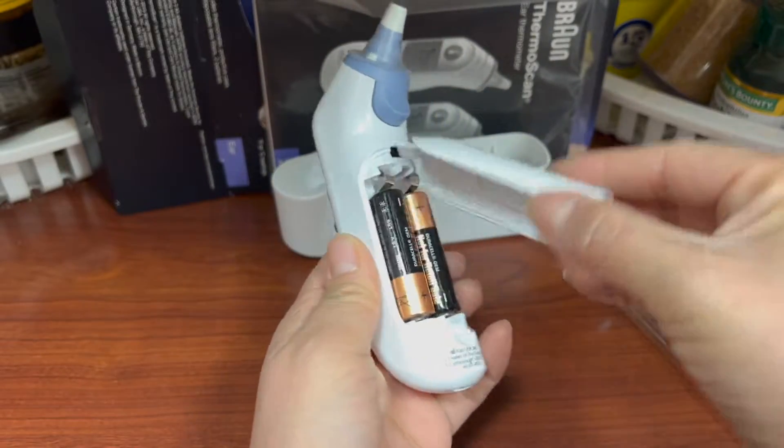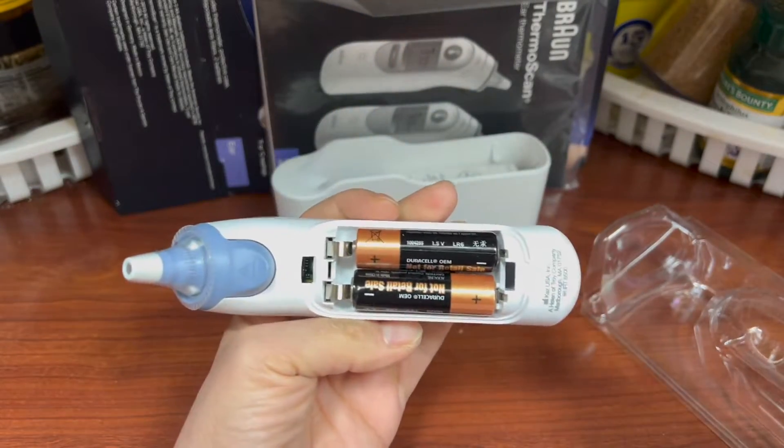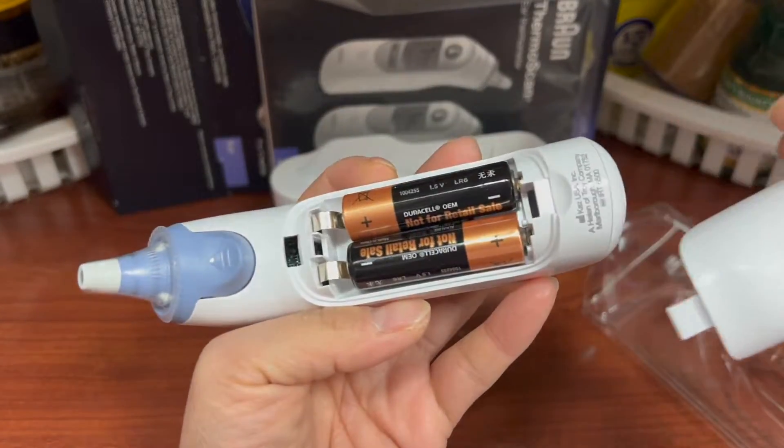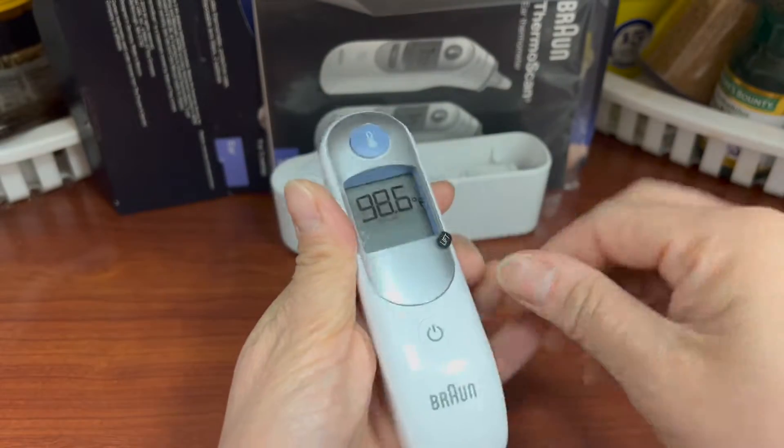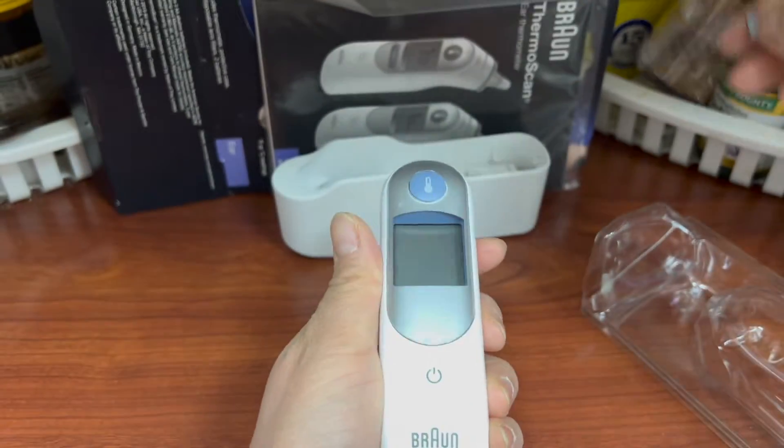It includes two Duracell AA batteries, which is very easy to get once you are out. But I believe you can use this for a long time.